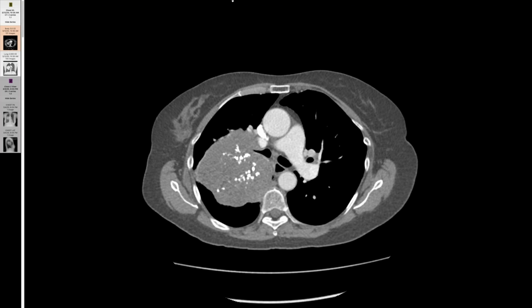So David, Howard, I think you had some comment you were going to make. Well, David, I was going to say that I agree with you about the hamartoma mesenchymoma issue, but I don't think the congenital pulmonary airway malformations are necessarily hamartomas, maybe one subtype, because they're airway malformations, and it's usually because of a foregut budding abnormality rather than a true mass, like of just disorganized tissue.